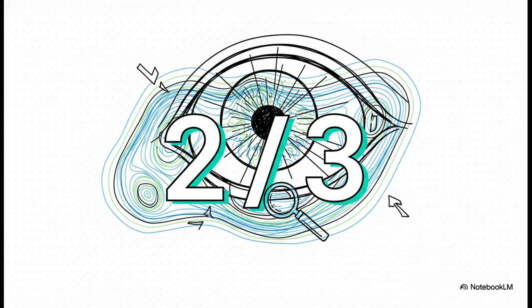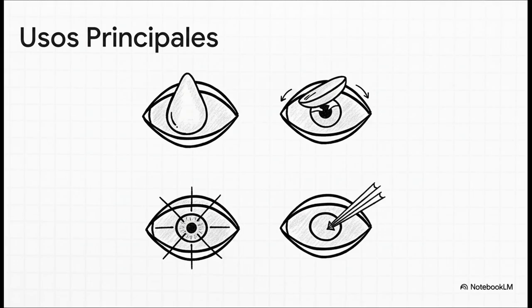The cornea is an absolute powerhouse, responsible for roughly 2/3 of the eye's total refractive power. That's about 43 diopters. So you can see why understanding its exact shape is absolutely vital for understanding a patient's vision. This importance leads us directly to its main clinical uses. Think of a topographer not as a single-use tool, but as a versatile platform. We use it to detect pathologies like keratoconus, to precisely fit specialty contact lenses like ortho-K, to evaluate visual quality issues, and of course, to plan and track the results of refractive surgery.